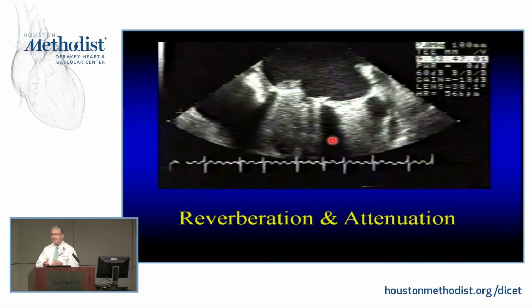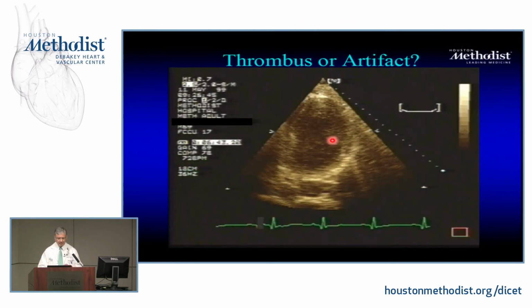And remember one thing, I know you're advanced, for Doppler, if you are attenuating, you're attenuating almost everything. I can't see beyond this calcification. Therefore, also, I can't see if there's any Doppler, if there's any flow, if there's anything else that you're processing. So it's important to keep that in mind, because if I can't see almost anything, then I can't ask my instrument to tell me.